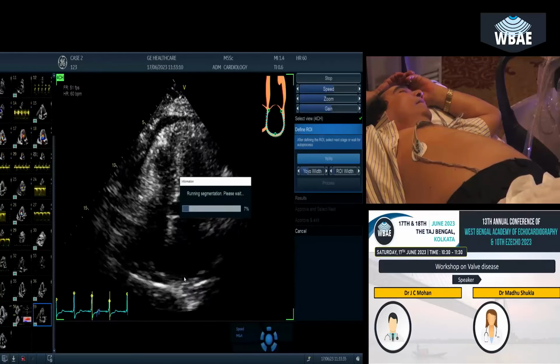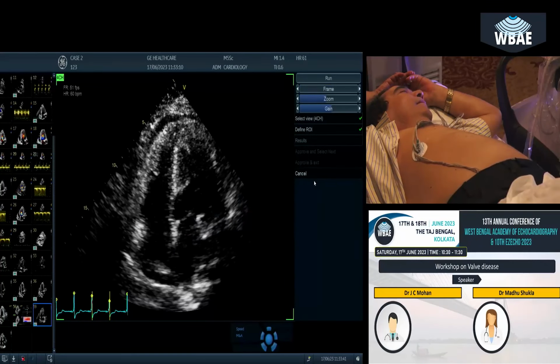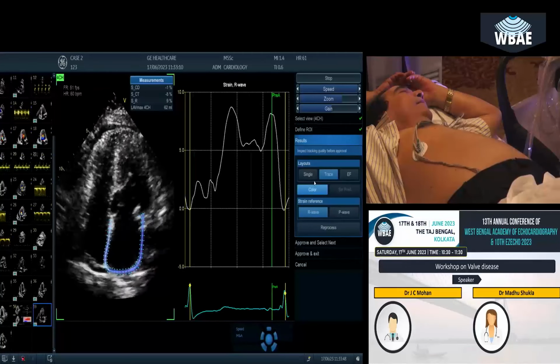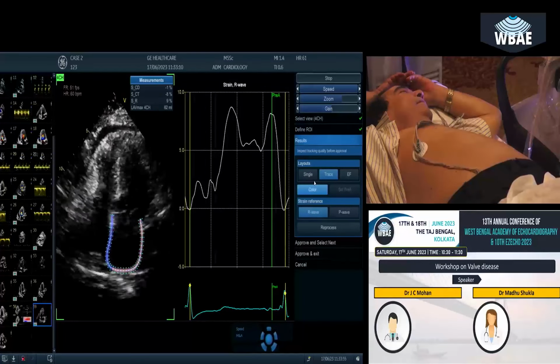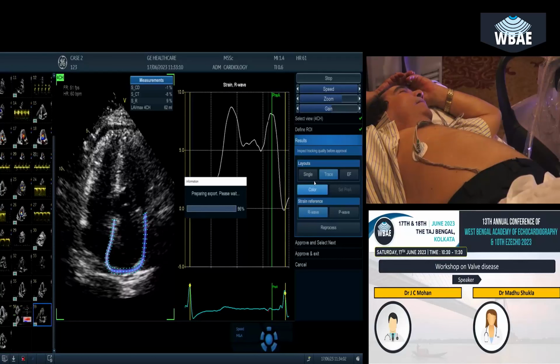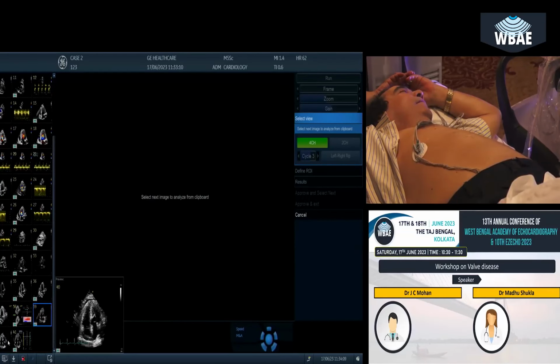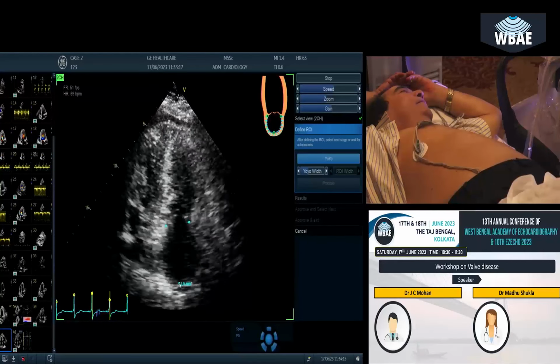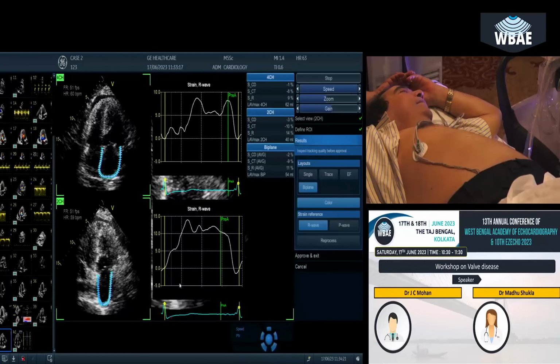Most machines have it. CVX has it. The E95 has it. That should bother you, 9%. I told you, in hypertrophic cardiomyopathy they are around a median of 15. These are more like 8, 9 actually. This should bother you. So if I have to write all the findings, I will say cardiac amyloidosis must be ruled out. The point is, any ventricle which gets thickened, crypts can be seen. All walls which get thickened, crypts can be seen.